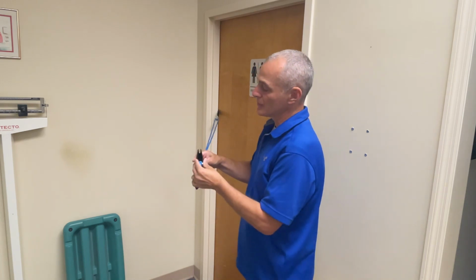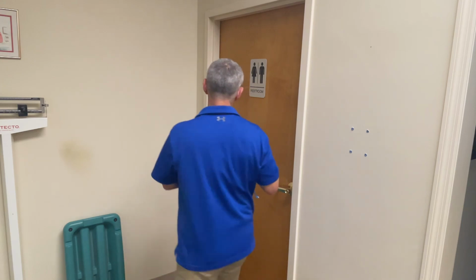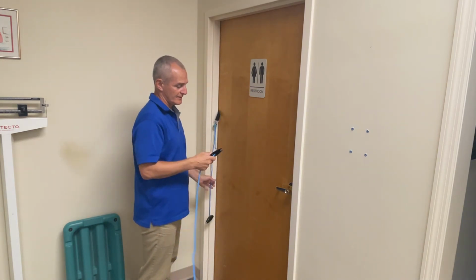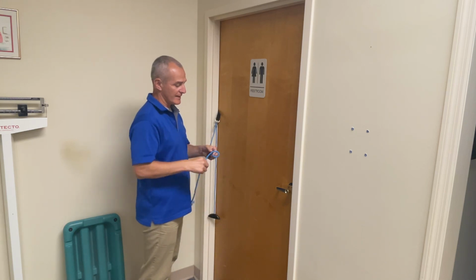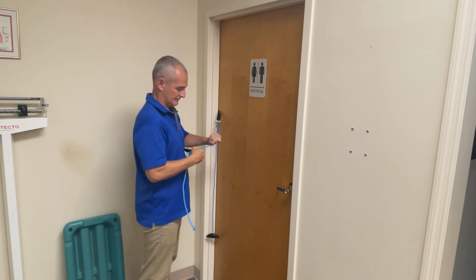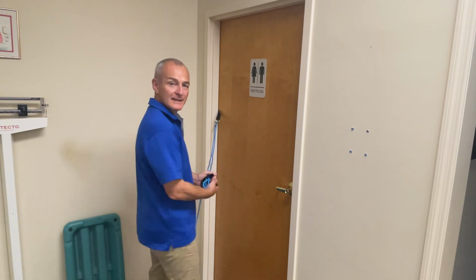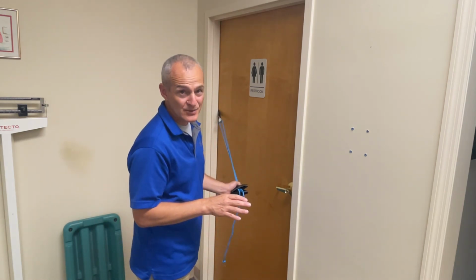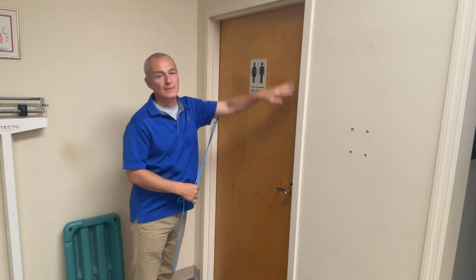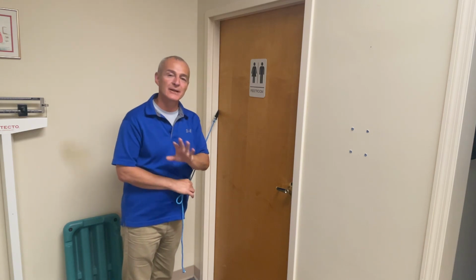I can also shorten the rope in case it's too long. If I want, I could come in here, I could tie a new knot, and so now I've got a shorter pulley system that I could use for any of the prescribed exercises. So you could effectively place this fastener anywhere around the door frame to get to the height that was prescribed by your physical therapist.